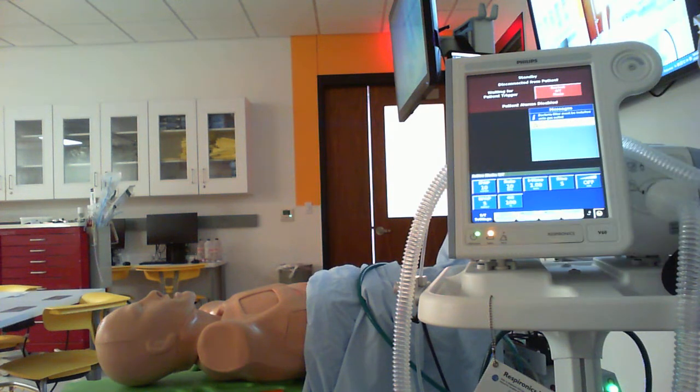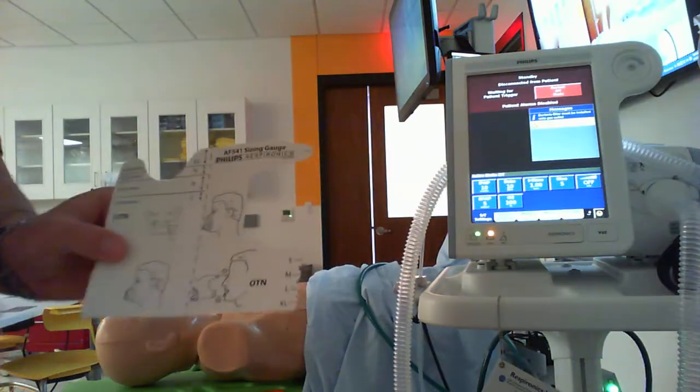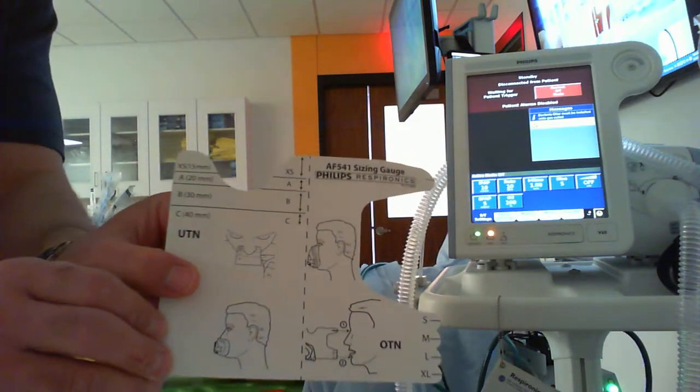Some of the screen is a little bit blurry on my webcam here, so I'm going to do my best to kind of point stuff out. All right, the circuit is already completed. I'm going to show you how to kind of select a mask. So every mask is a little bit different. Most of them are going to come with their own little sizing guides.